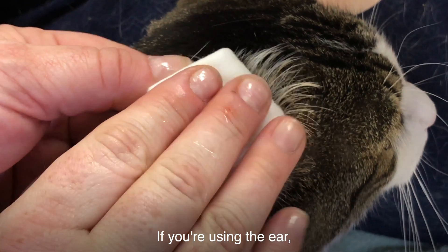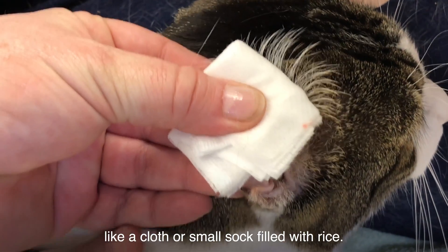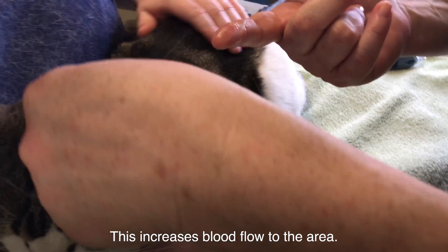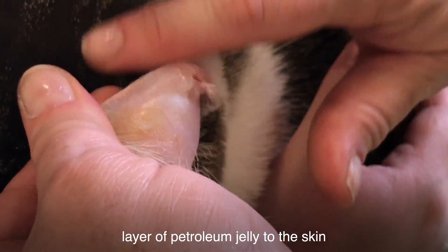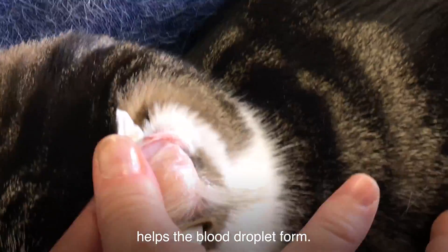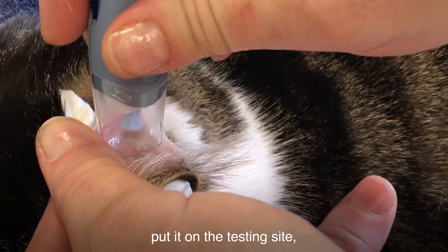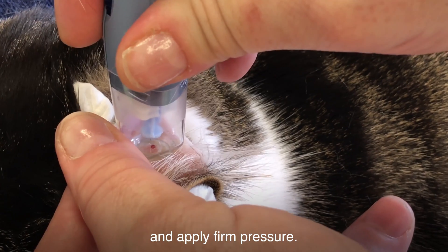If you're using the ear, warm it up by rubbing it or applying a warm compress like a cloth or small sock filled with rice. This increases blood flow to the area. Some people find that applying a thin layer of petroleum jelly to the skin helps the blood droplet form. If you're using a lancet device, put it on the testing site and click the button.